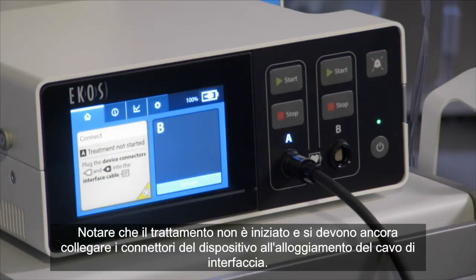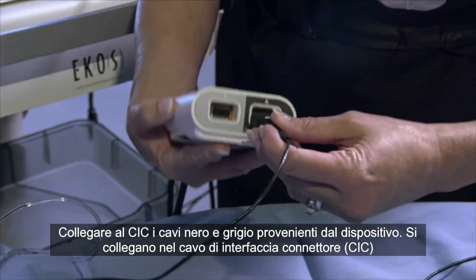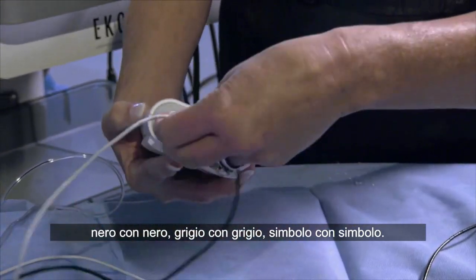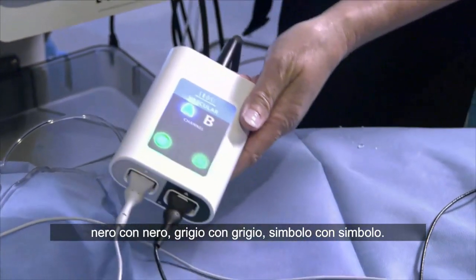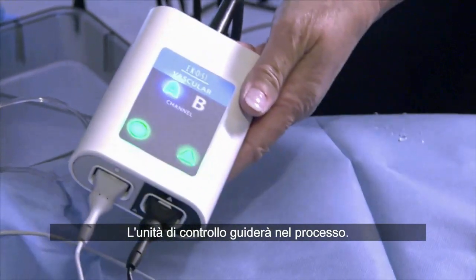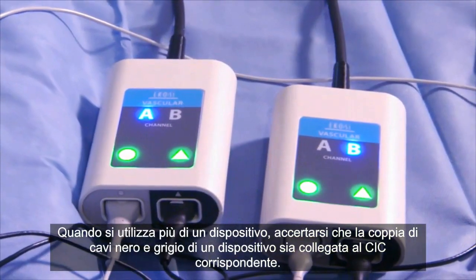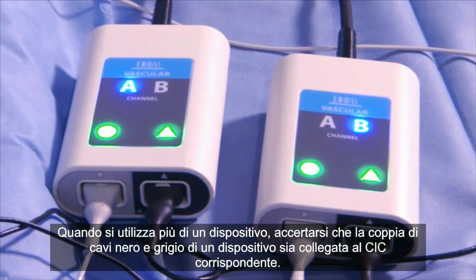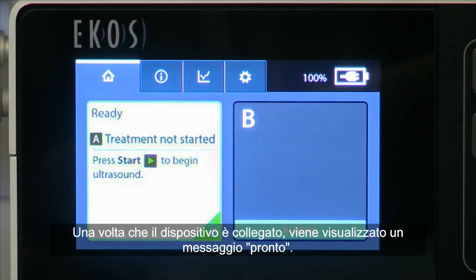Notice that treatment has not started, and we will still need to plug the device connectors into the interface cable housing. Connect the black and gray cables from the device to the CIC. They plug into the connector interface cable, black to black, gray to gray, symbol to symbol. As you can see, the CIC indicates which channel it is plugged into. When using more than one device, check to make sure that the black and gray cable pair from one device is connected to the same corresponding CIC. Once the device is connected, a ready message is displayed.